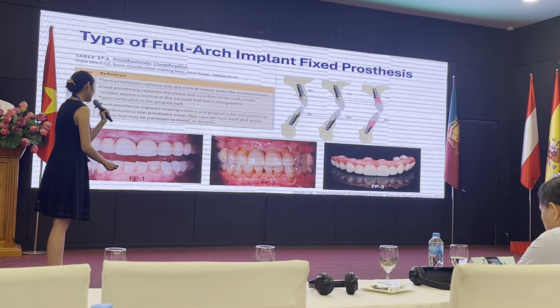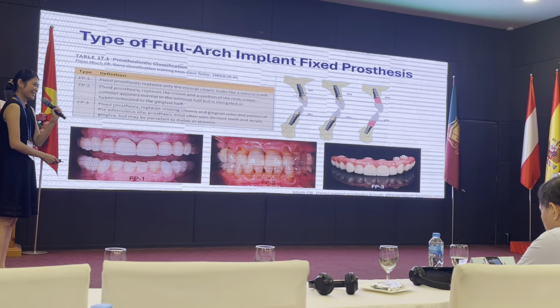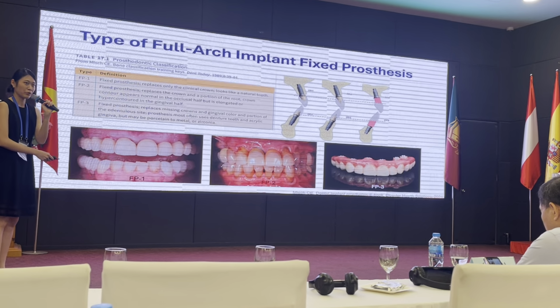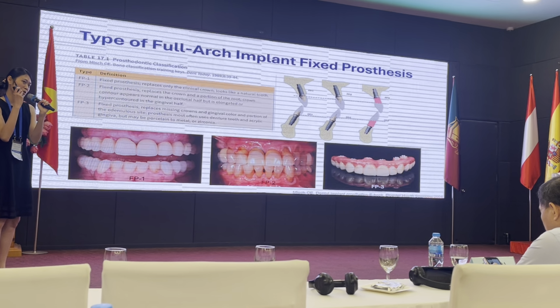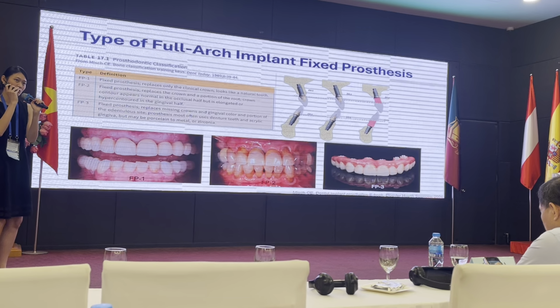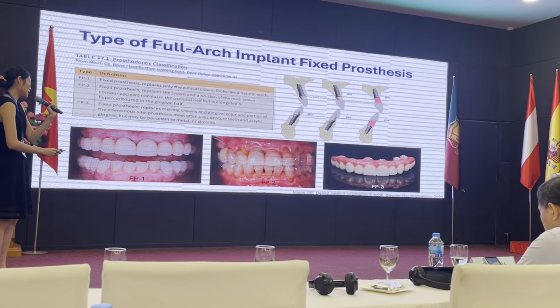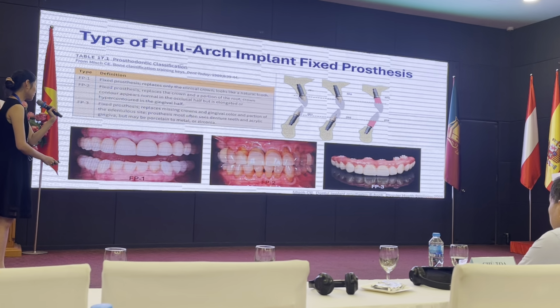And this is from Dr. Mish. So Dr. Mish actually published this in a magazine. So he talks about when we do a full arch implant prosthesis, how do we classify our restoration? So first thing, if you have a dental patient, you want to know how much tissue and bone support that you want to have.